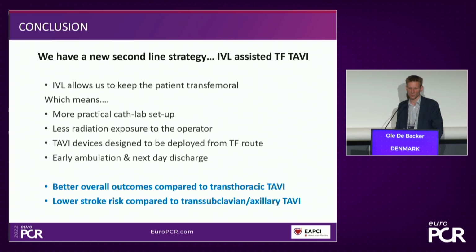So as a final concluding slide, I think for me it's a new second-line strategy, that IVL-assisted transfemoral TAVI. It allows me to treat the patients transfemoral. And it has a lot of benefits. It's a more practical cath lab setup. People who have done alternative access TAVI, you go out of your comfort zone or your routine.